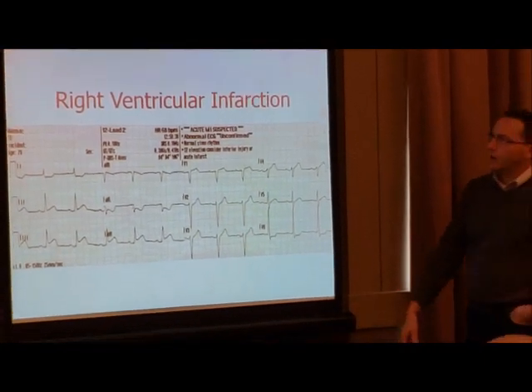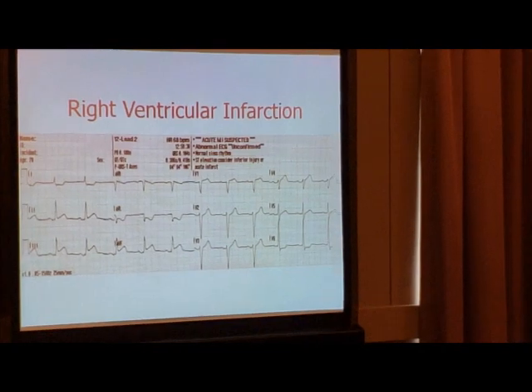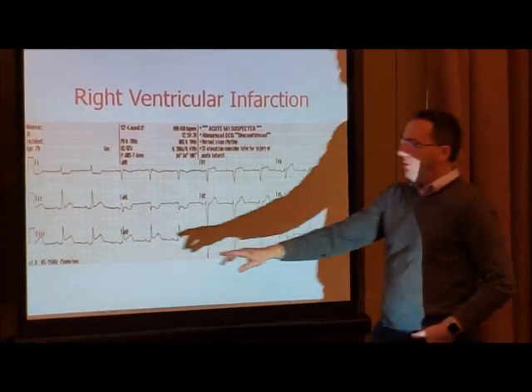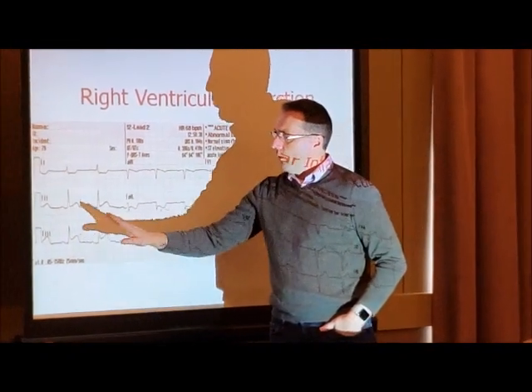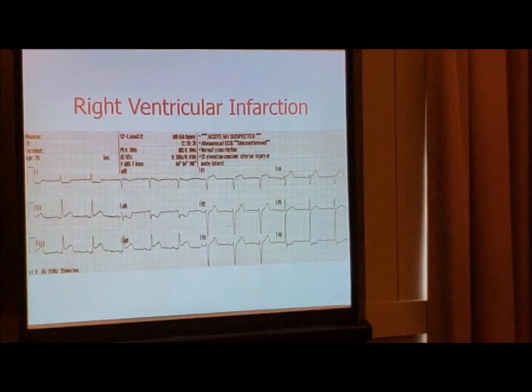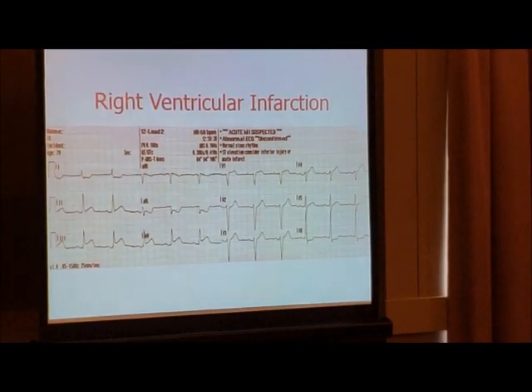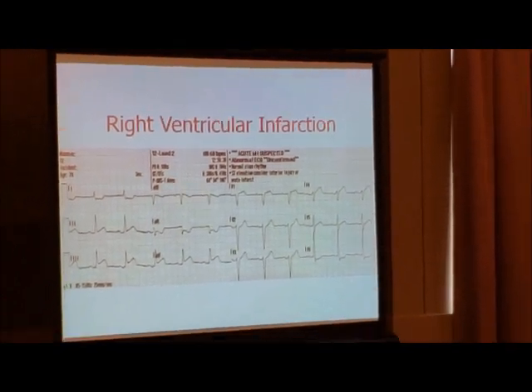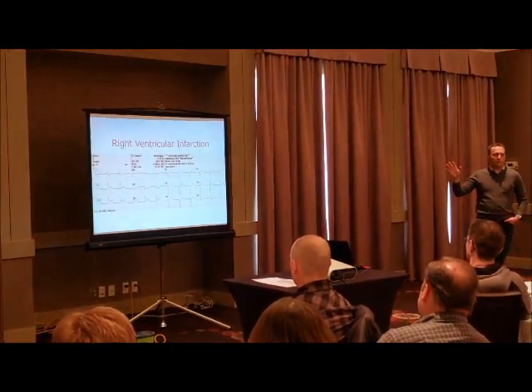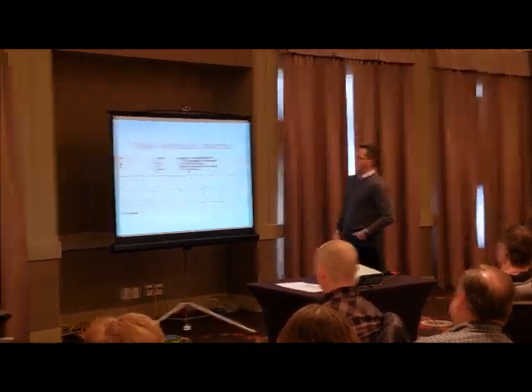It's regular. QRS duration, 104 milliseconds. Is that less than 120? Yeah, so we have narrow QRS complexes. If we go over to lead 2 here, we have P waves in a one-to-one relationship with the QRS complex with a normal PR interval. Pretty normal, yes, normal PR interval. So we have sinus rhythm on the monitor. Okay, where is our ST elevation on this ECG? Leads 2, 3, and aVF. Okay, so lower left-hand corner, we have ST elevation in 2, 3, and aVF.